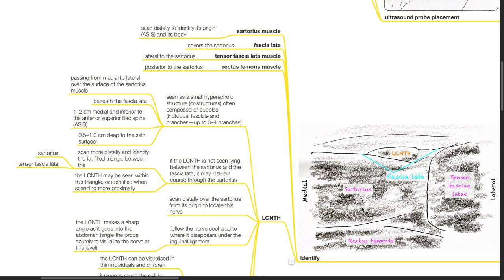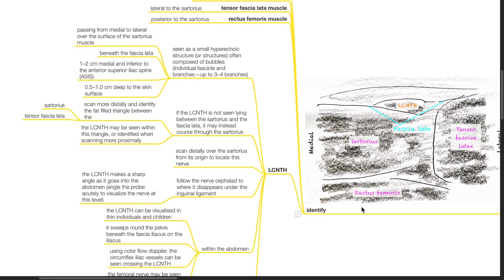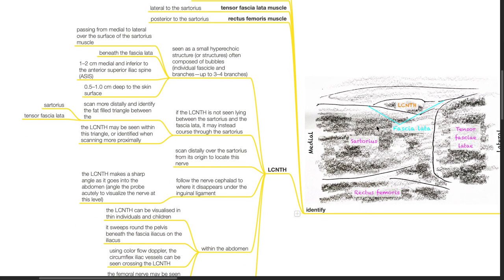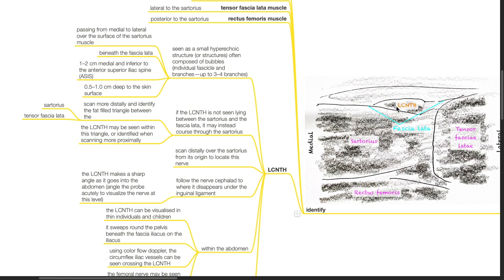The lateral cutaneous nerve of the thigh is seen as a small hyperechoic structure or structures often composed of bubbles which indicate individual fascicles and branches. Up to 3 to 4 branches may be seen. It is seen passing from medial to lateral over the surface of the sartorius muscle beneath the fascia lata, 1 to 2 cm medial and inferior to the ASIS and 0.5 to 1 cm deep to the skin surface.